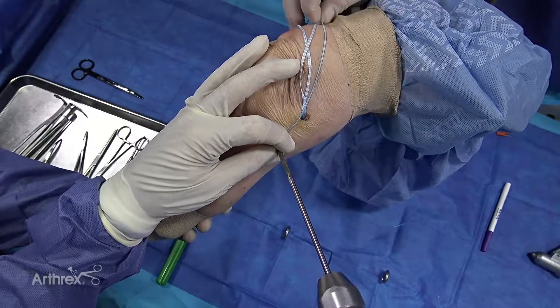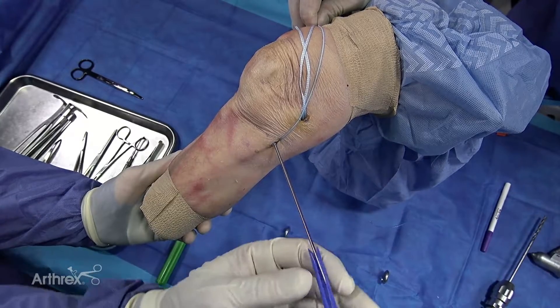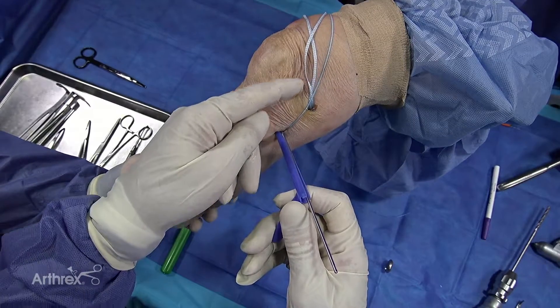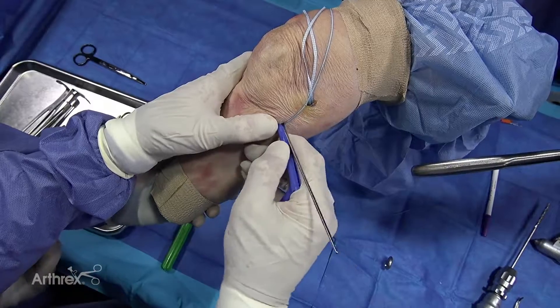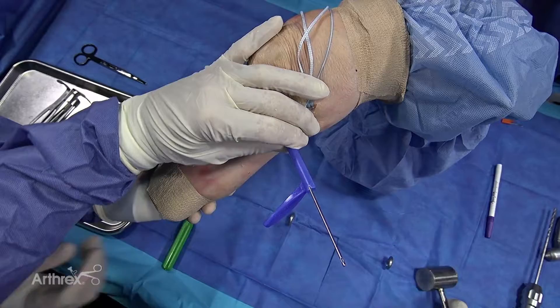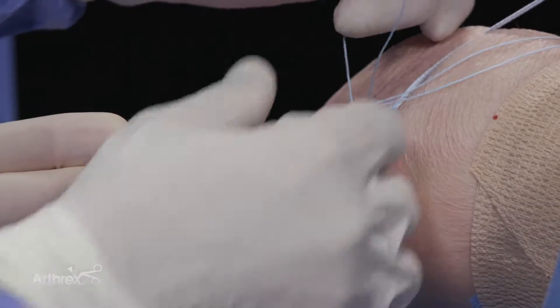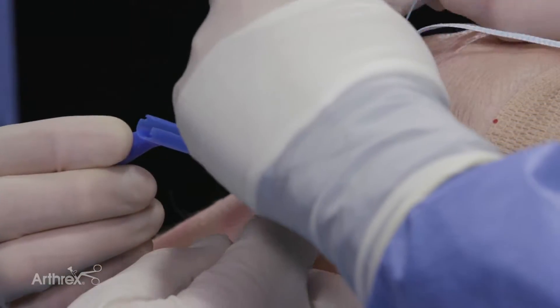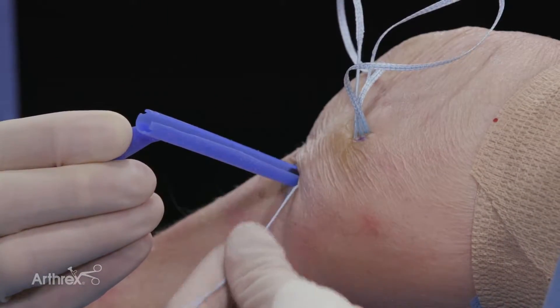I really want to make sure that thing stays in there. The important thing is the slot has to face the fiber wire — the fiber tape — the slot has to face that. You've got to put it in there and really tap it in, and keep it right there. Do not let that move, because that's the most important part of the case. So then what you do is you take this out, take the loop out, put the fiber tape in here, and pull the fiber tape out and load it onto your swivel lock.